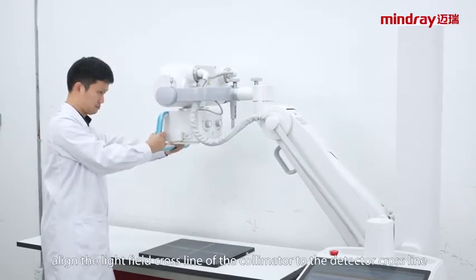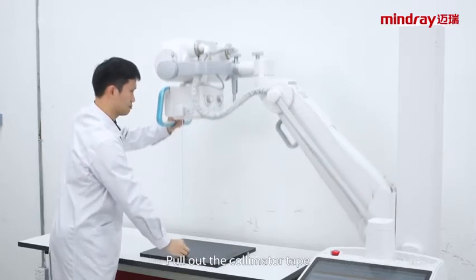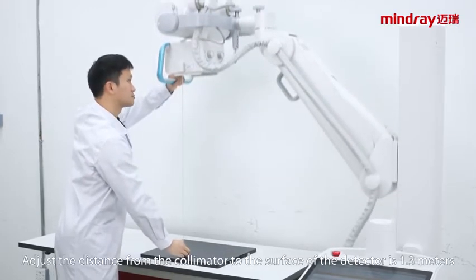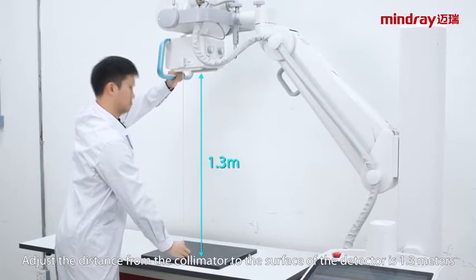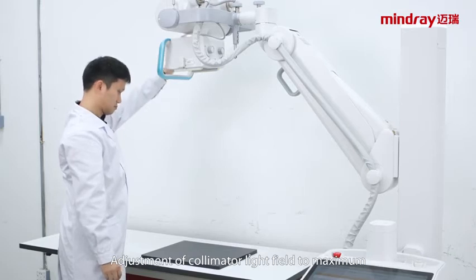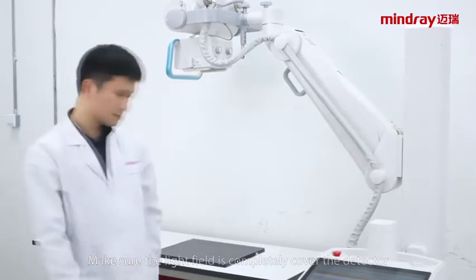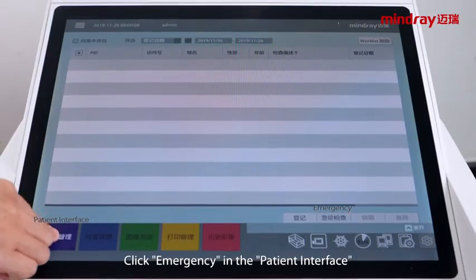Align the light field crossline of the collimator to the detector crossline. Pull out the collimator tape. Adjust the distance from the collimator to the surface of the detector to 1.3 meters. Adjust the collimator light field to maximum, making sure the light field completely covers the detector. Click emergency in the patient interface.